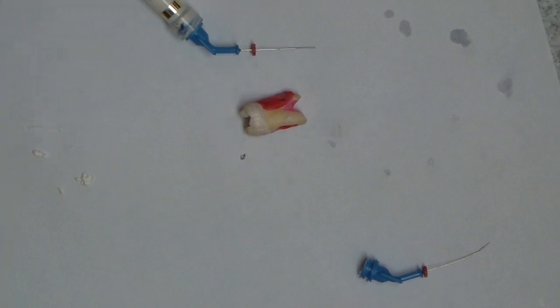It's ShaleThingsCentury.com. So it's fairly well accepted at this point, March 2012, that an intracanal medicament we're commonly using—there are probably hundreds of them—is calcium hydroxide. It has its pluses and benefits, but classically right now, say between phases of retreatment, or depending on your peri-radicular tissue diagnosis, you may be using intracanal medicament.